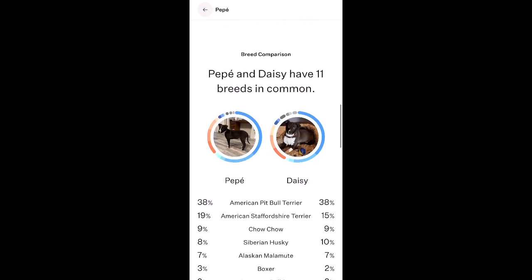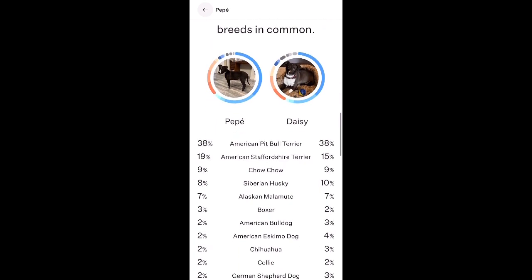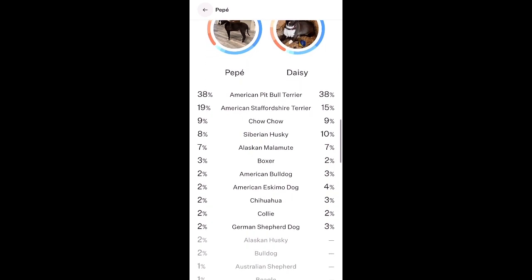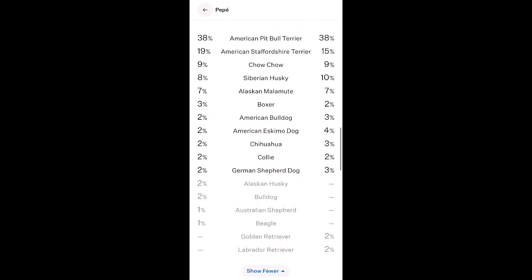As you can see here, the Wisdom Panel actually shows off the percentages that Pepe and Daisy both share and have in common. And there are some breeds that don't match up with one another, and that is something that I learned: these are mutts, which are just heavily mixed dogs, and their mom could have had one litter, but each puppy could have had 10 different dads, is what I learned.